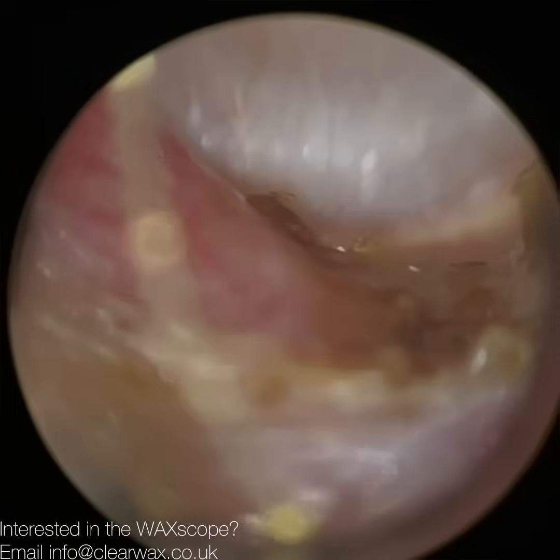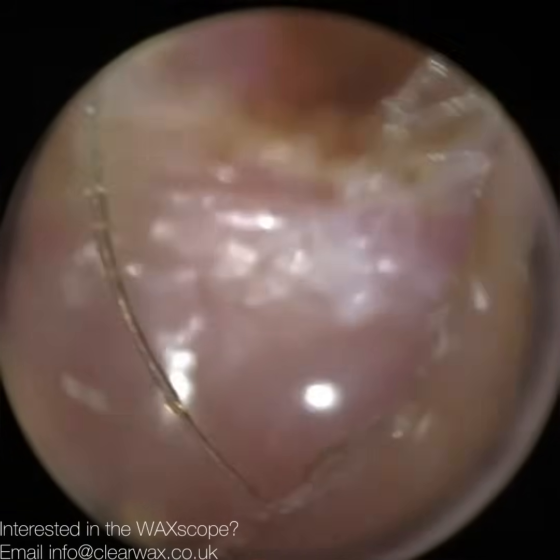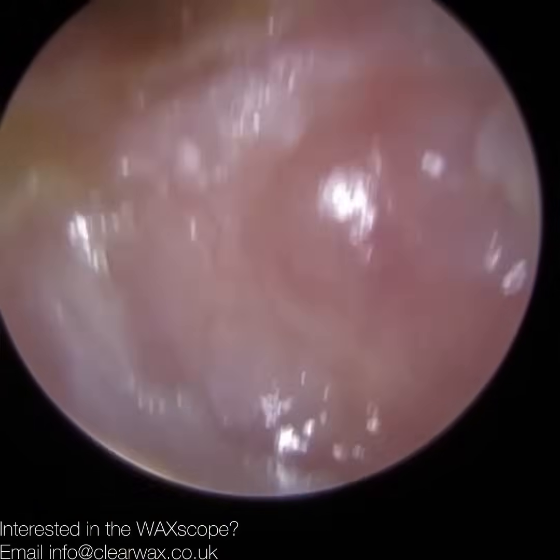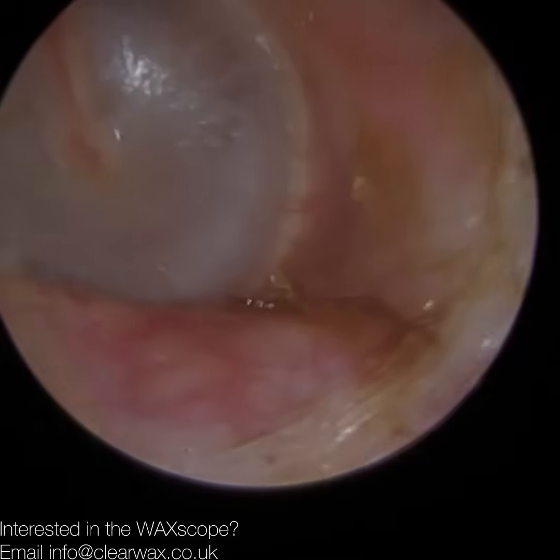You've got a beautiful view of the eardrum. See all the blood vessels supplying the hammer bone. So I'm just having a good nosy around in there. Now this is the endoscopic view. So yeah, with an endoscope you get a much wider field of view, but I just want to make sure I've done a good job here, and I'm really pleased with that.